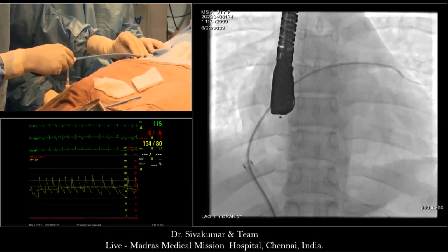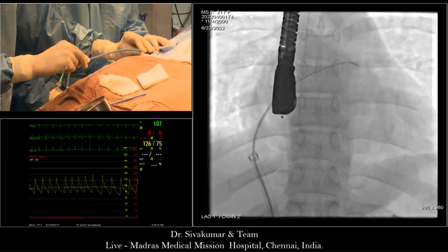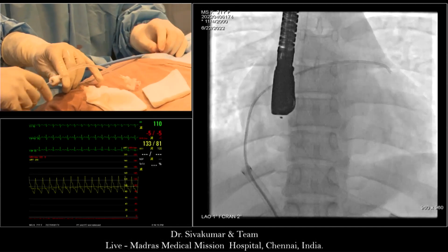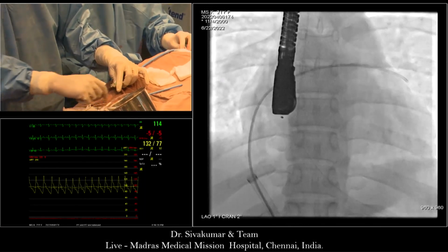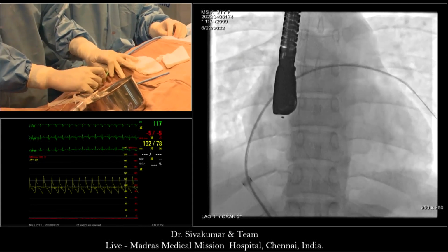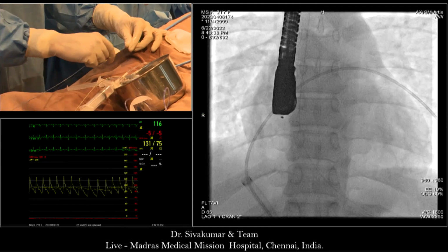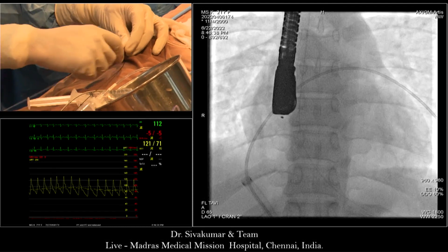The problem about the left superior or right superior pulmonary venous technique is it is not so predictable. Sometimes you are too much inside, so there is no disengagement, and sometimes you are too much outside, so there is a premature disengagement. For predictability, you may have to use some more modification. Get me the Amplatz Super Stiff. Well, we're learning a lot, because he's done it twice. Get me another 14 French Mullins sheath.